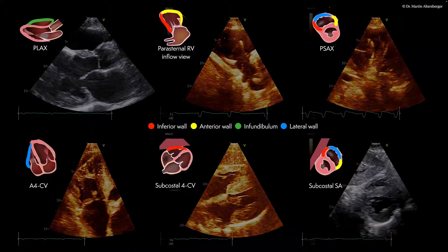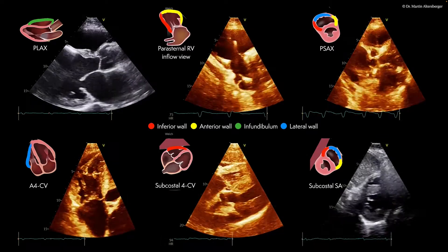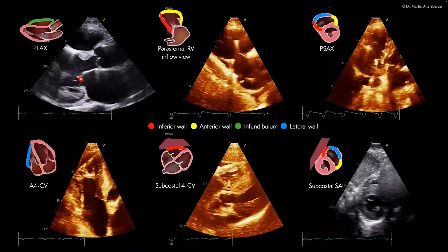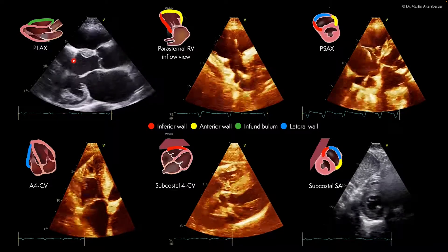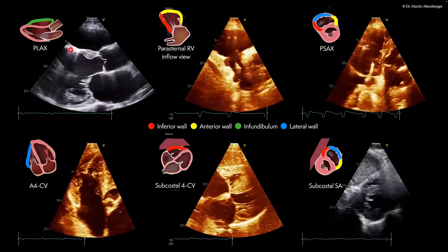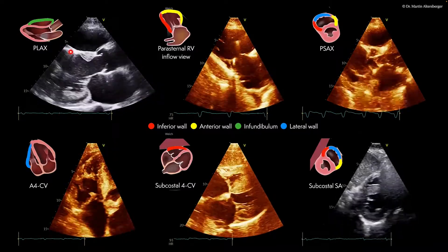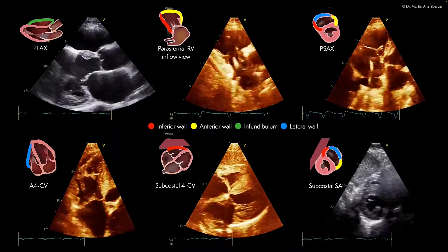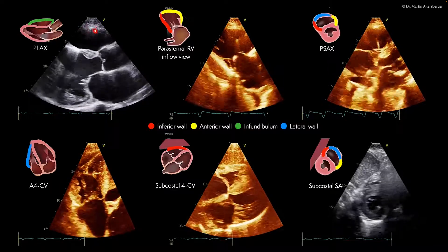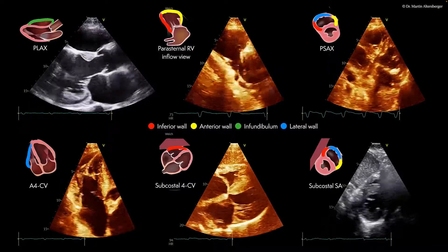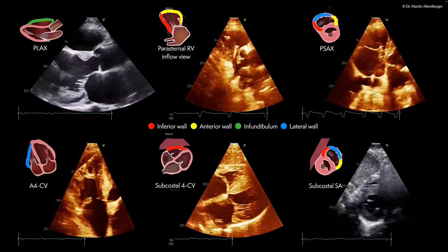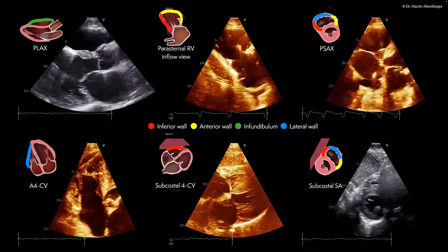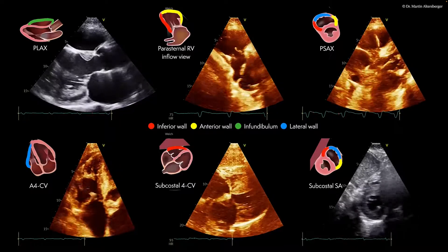Moving on to pathological examples, here we have several loops where we can appreciate that there is definitely a reduction in left ventricular function present. Here we see a hyperechoic interventricular septum — this is a scar, so this is probably ischemic heart disease. And over here we see again the infundibulum of the right ventricle, and already in this view the function of the right ventricle seems impaired — not severely impaired, but definitely not normal as we have seen before.